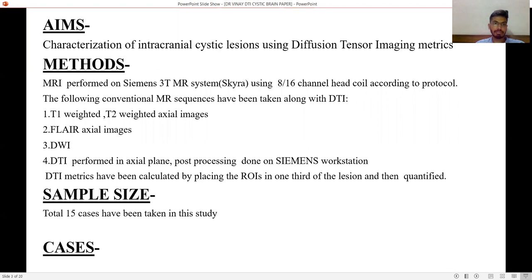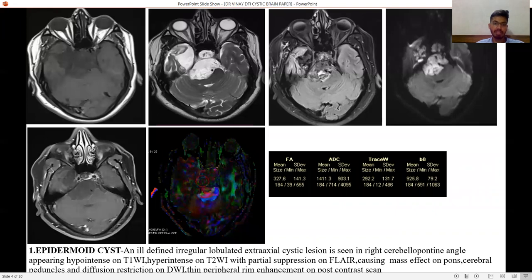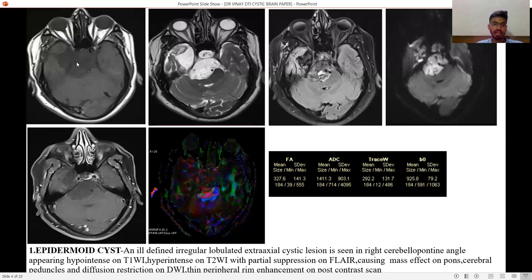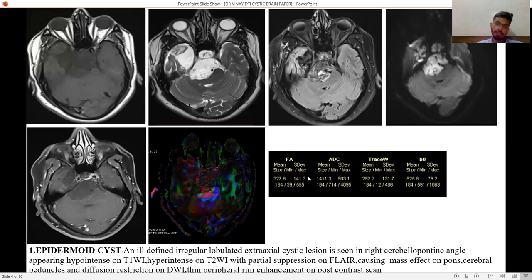Aims: Characterization of intracranial cystic lesions using diffusion tensor imaging metrics. Total sample size taken is 15 cases. First is epidermoid cyst — an ill-defined irregular lobulated extra-axial cystic lesion is seen in the right cerebellopontine angle, appearing hypointense on T1, hyperintense on T2, with partial suppression on FLAIR images, causing mass effect on pons and left cerebral peduncle, and showing diffusion restriction on DWI with thin peripheral rim of enhancement on post-contrast scan. The FA value (fractional anisotropy) is highest at 0.327.